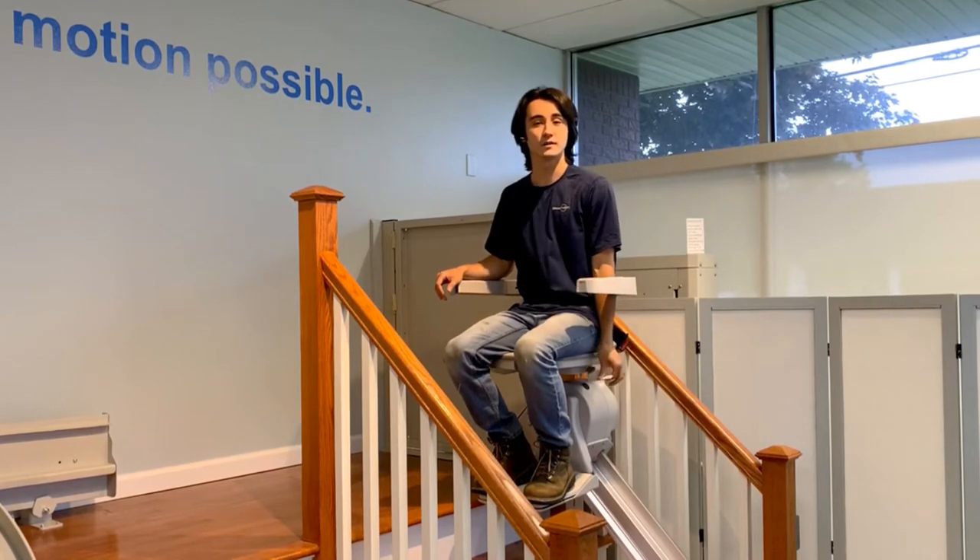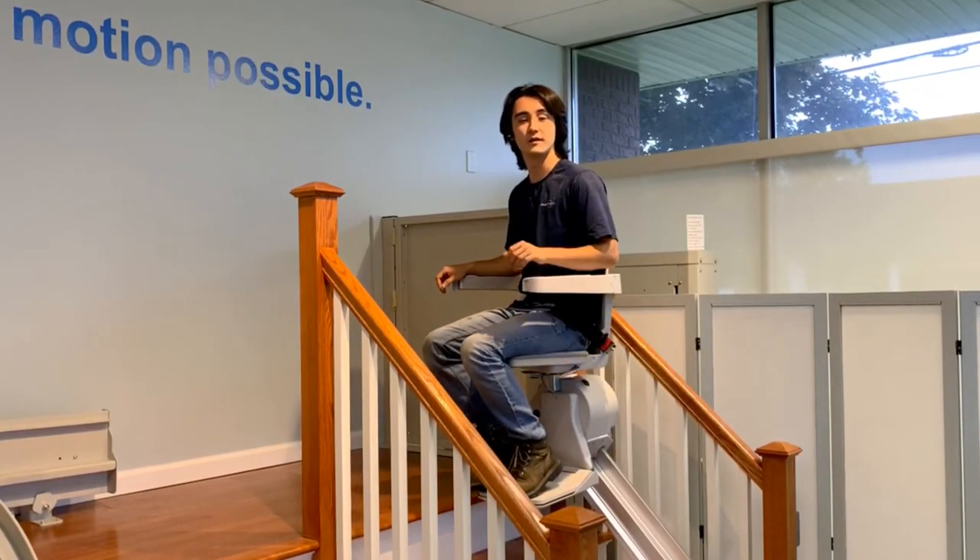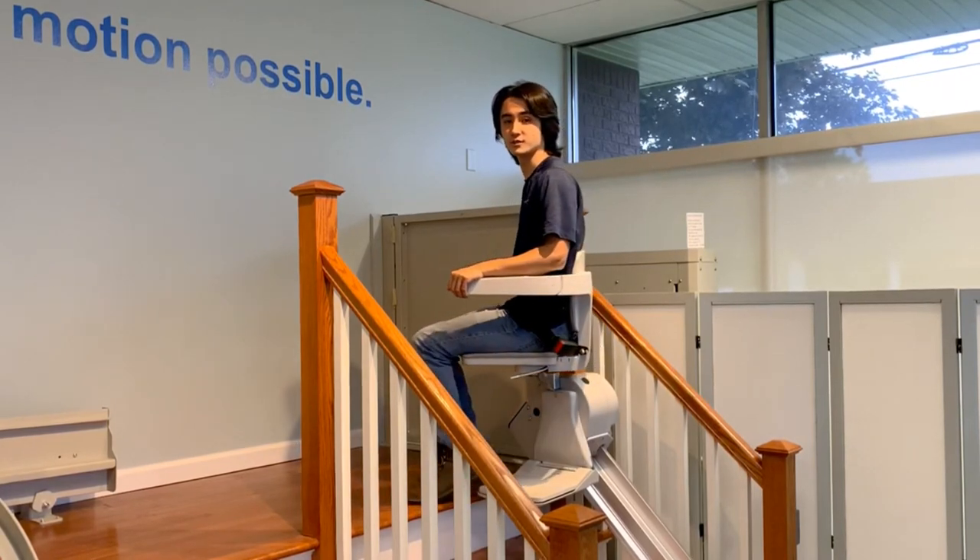To swivel your chair, push down the lever, use your legs to swivel, let go, and the chair will lock into the discharge position.